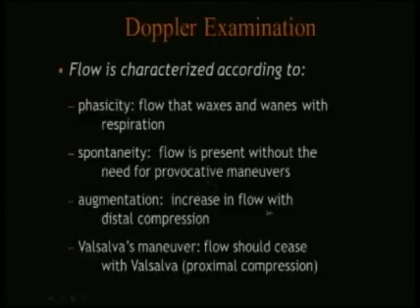Augmentation is something that we look for occasionally. An augmentation is an increase in flow with distal compression that can sometimes be helpful if there are segments in between where you're compressing and where your transducer is that are not visualized for whatever reason, whether it be overlying dressings or perhaps you can't compress it because the patient can't tolerate a compression. You can sometimes document patency by doing an augmentation maneuver.